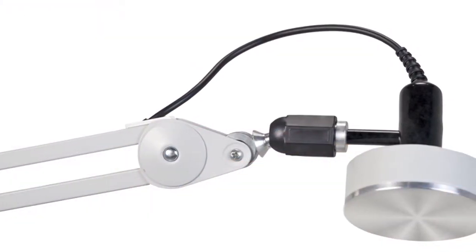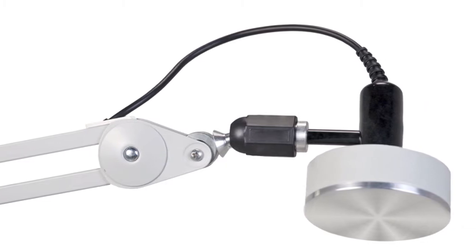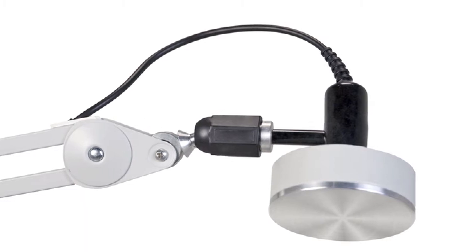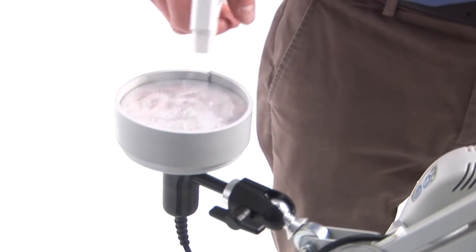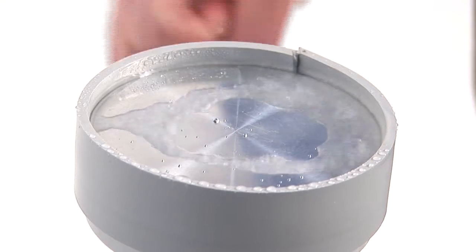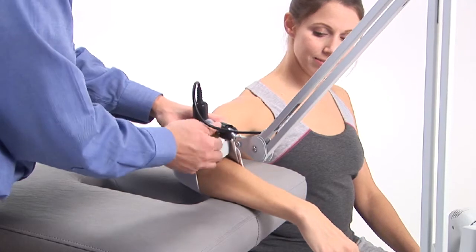The surface area of our unique sound head is three and five-eighths inches in diameter, which is five times larger than most conventional sound heads. Unlike a conventional sound head that has to be moved continuously, the HF54 disperses the intensity over a large area to deliver ultrasound at a safe, effective, and calculable rate. Each sound head is engineered with three piezoelectric crystals that are harmonically set to operate as one large crystal. The sound head is mounted on a universal joint for perfect positioning.